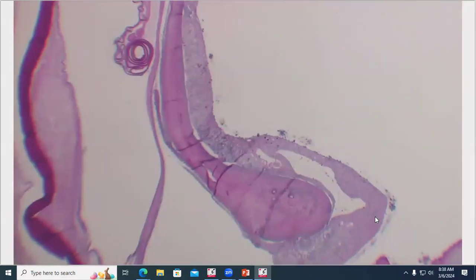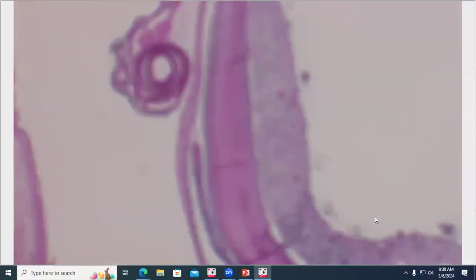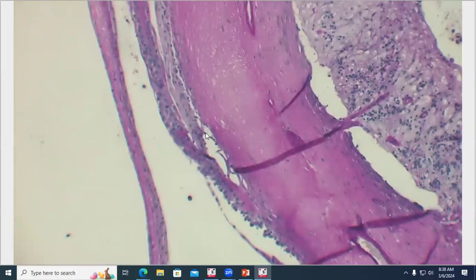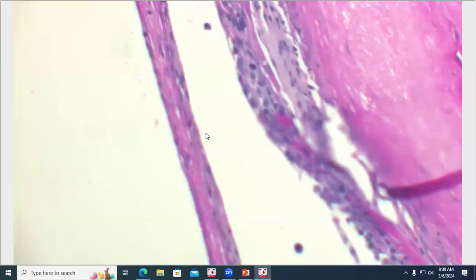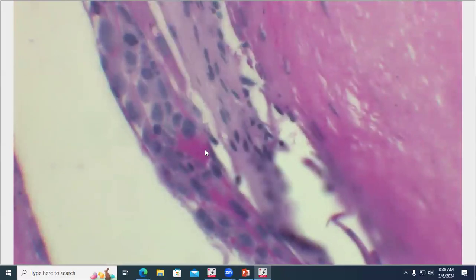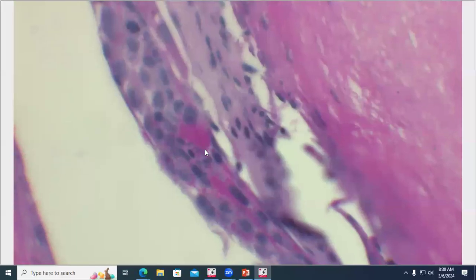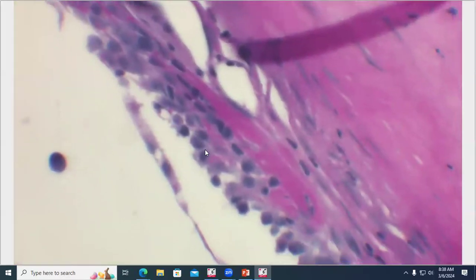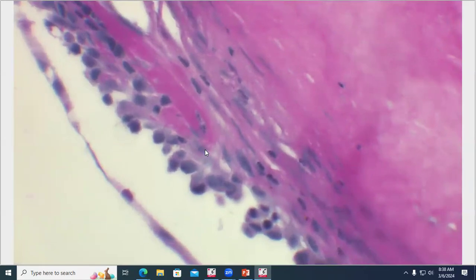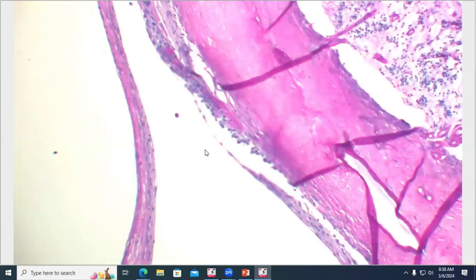So I have a PAS stain. Can't see, let's go back. All right, let's see if I can, maybe sometimes it's very subtle. So we can see this nice, strong magenta staining to the lens capsule here. Let's see if I can find that special spot. And kind of amongst the neoplastic cells, you can see kind of fragments and, sorry, it's a little bit wrinkled here, but you can see the bright magenta material being produced by these neoplastic cells. So consistent with malignant transformation of the lens epithelium, producing this sarcoma.